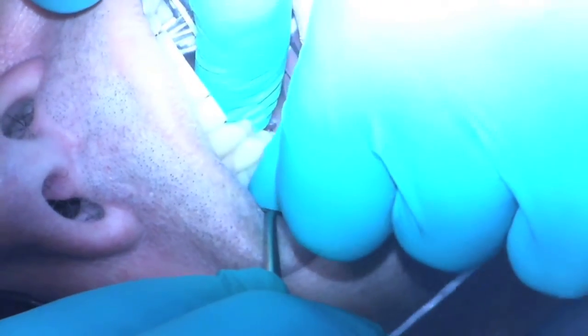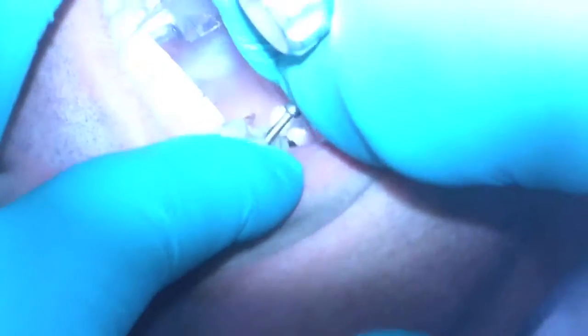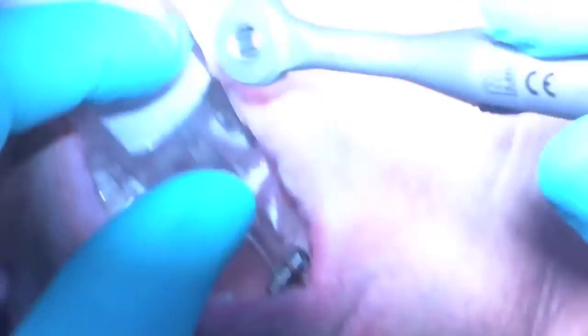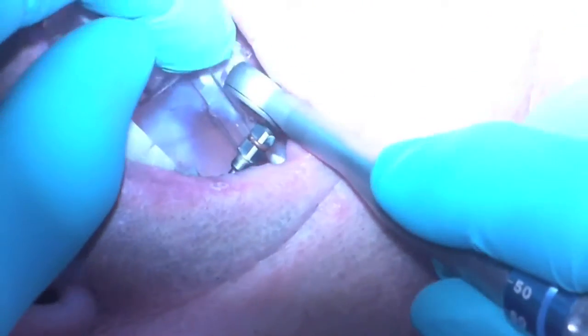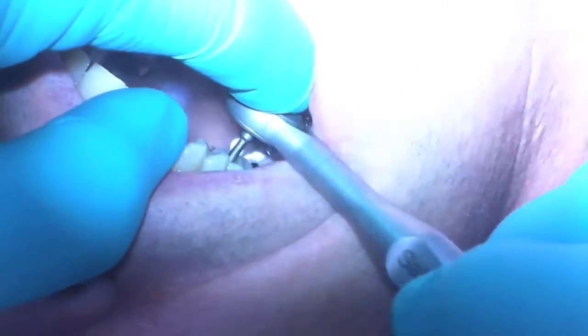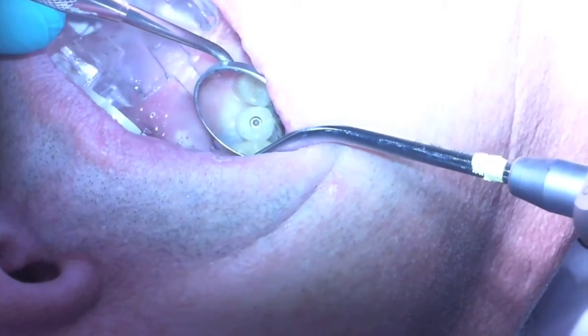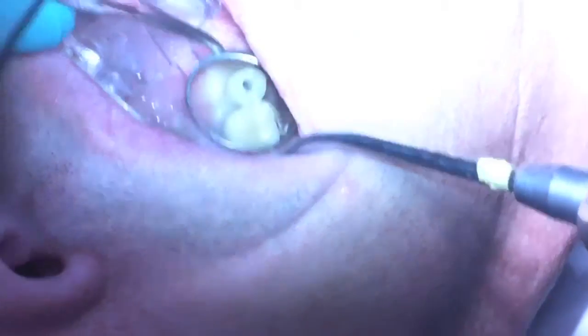Again, this is using the Implant Direct torque wrench, predetermined. So you can determine what torque you want. Again, 30 is what I'm using here for the Implant Direct, and I torque it down to 30. I pre-choose it, and it clicks when you're at that level. Again, checking the bite. Add my composite, and we're done there.